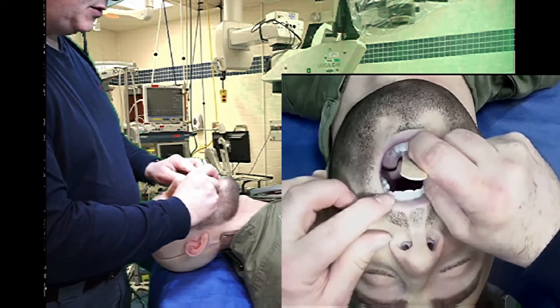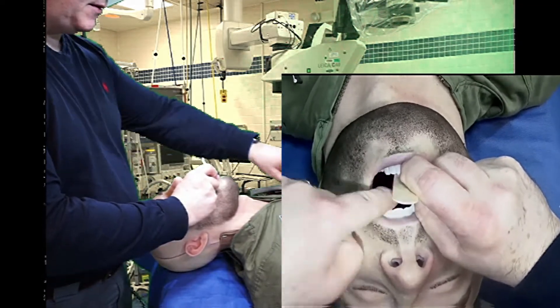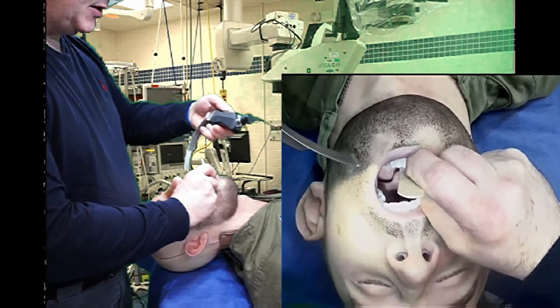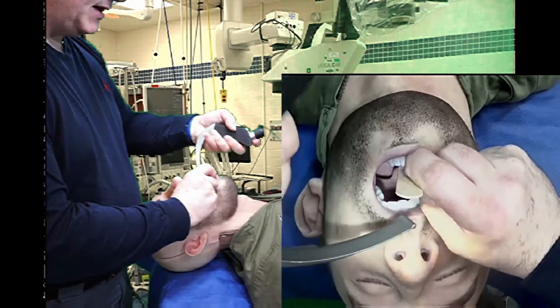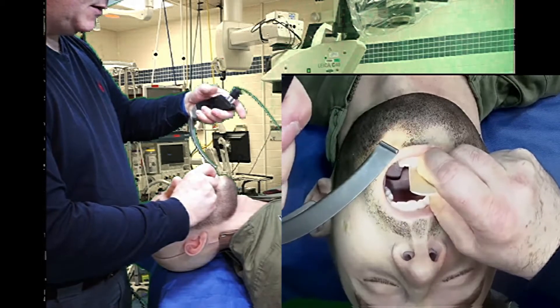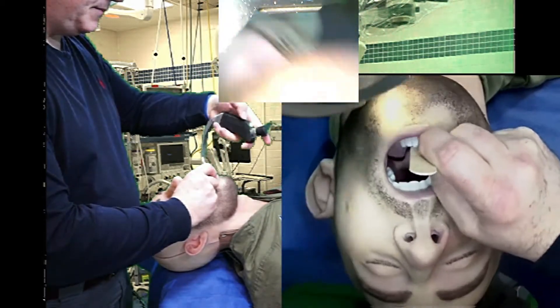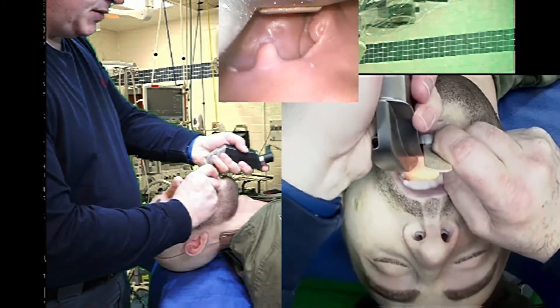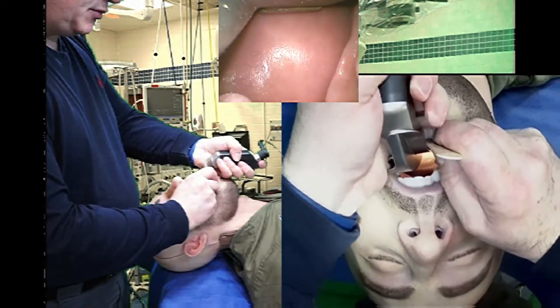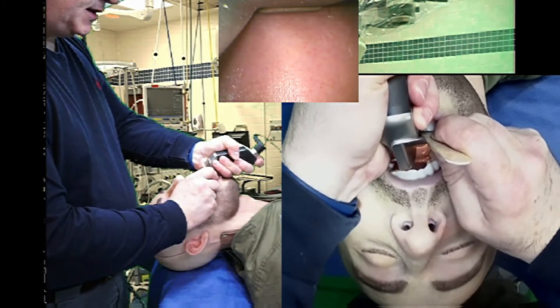I'm going to push the mandible inferiorly, contain the tongue into the floor of the mouth of the mannequin, and then I'm going to use that to allow me to place my video Mac here. I'm going to sync this video Mac here with one of my external videos. I'm going to place it straight over the top of that tongue depressor so that I'm compressing both the tongue and the tongue depressor.